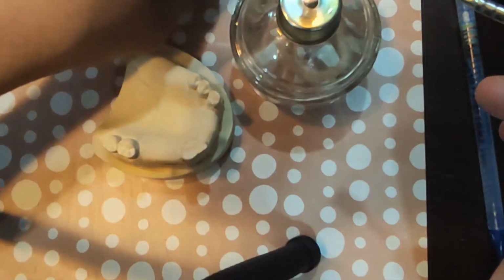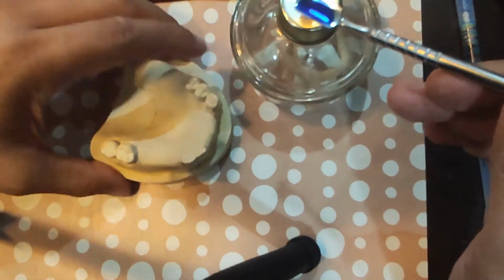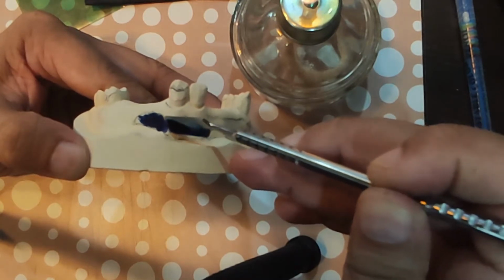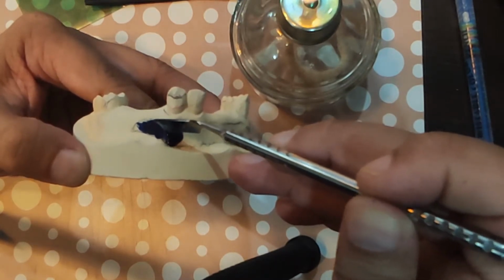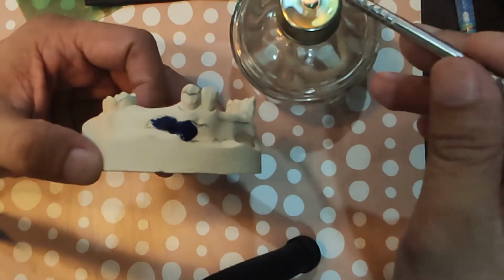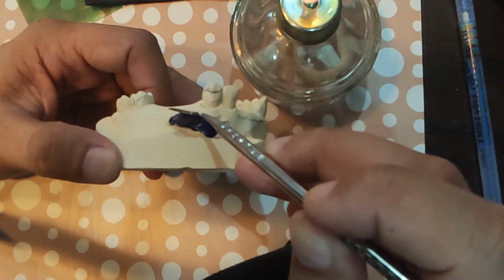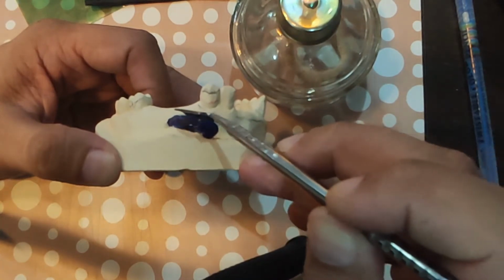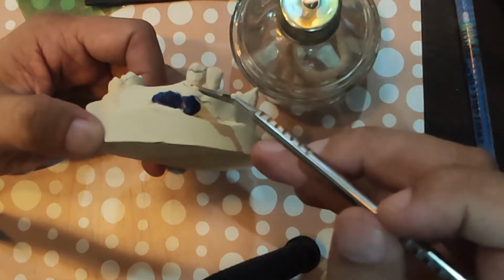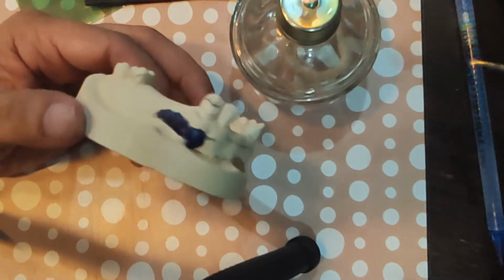Add more. Okay, so you can overfill that part, and then you just use an instrument to carve out yung excess.